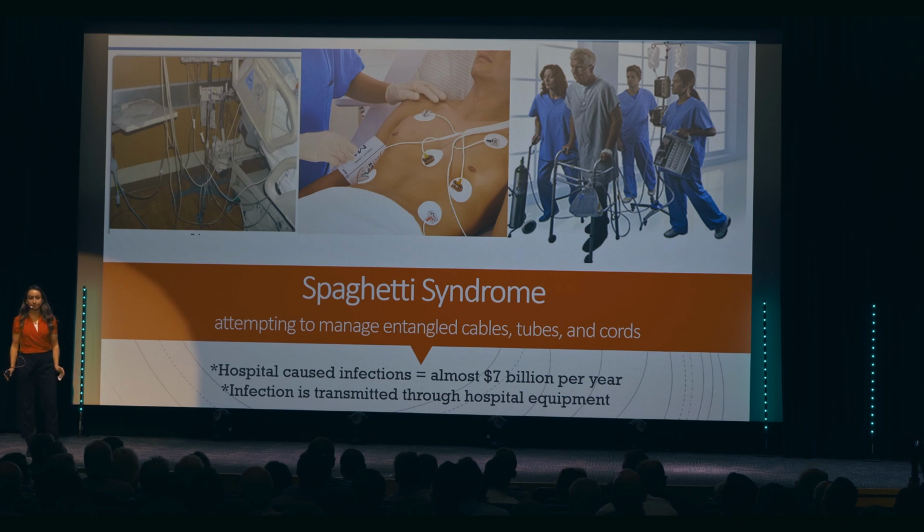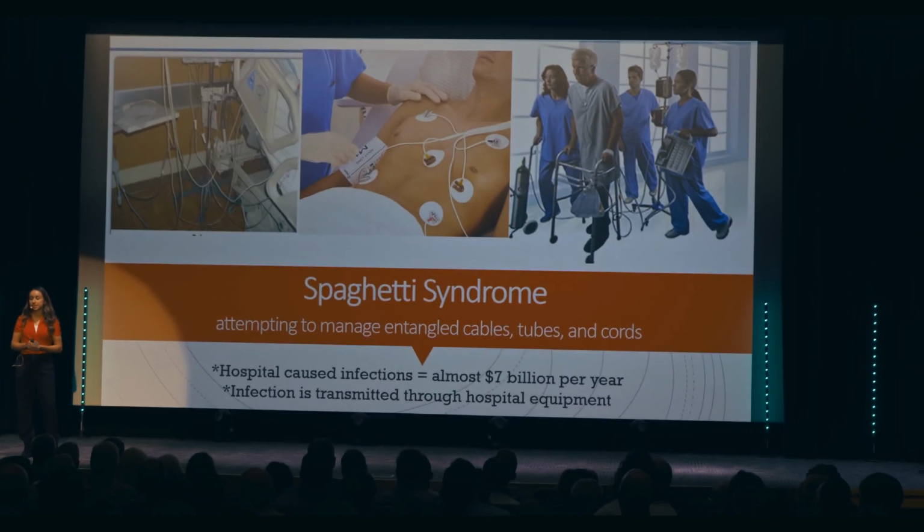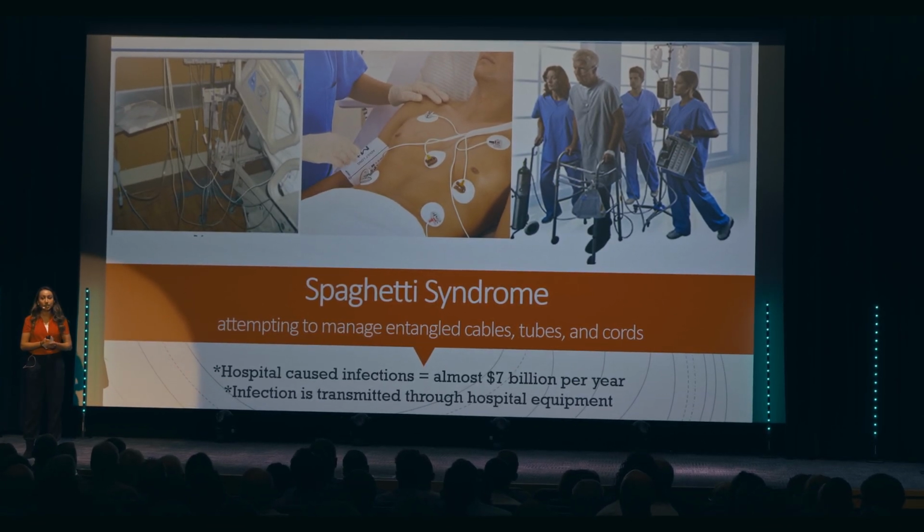Second, infection. In a 2015 study, the infections were seen to have a common source of contamination through telemetry leads. Telemetry leads are electrocardiogram cords that are connected to a patient's chest, as shown. These cords detect abnormal heart rhythms. Sounds very important, right? However, nurses temporarily disconnect these cords every time a patient showers or every time they go for a walk. And let's be honest, the nursing ratio of 3-to-1 for patients does not exist right now.